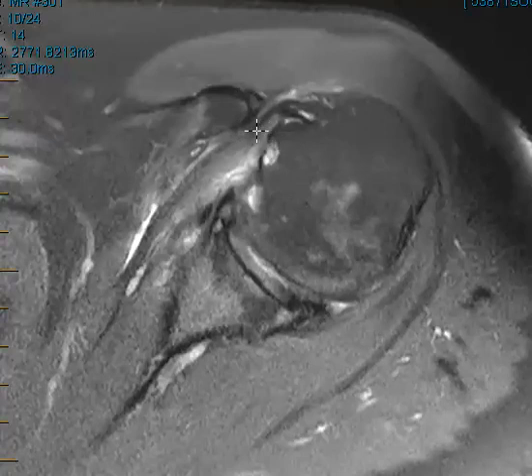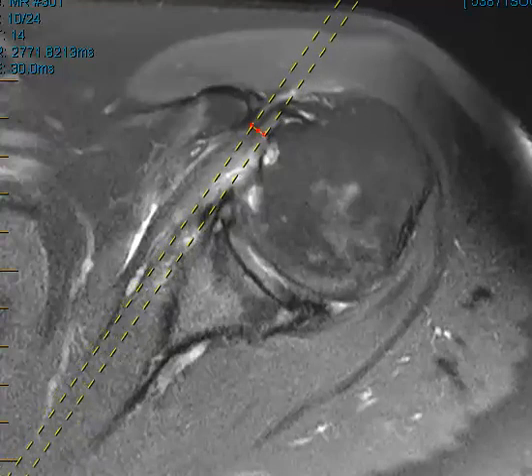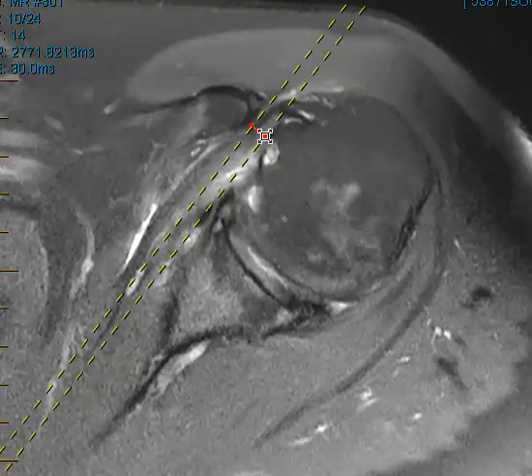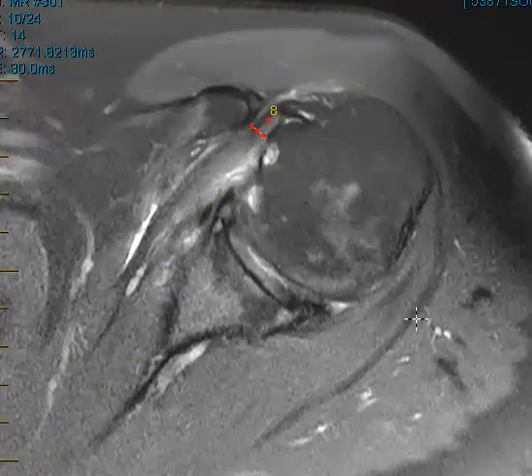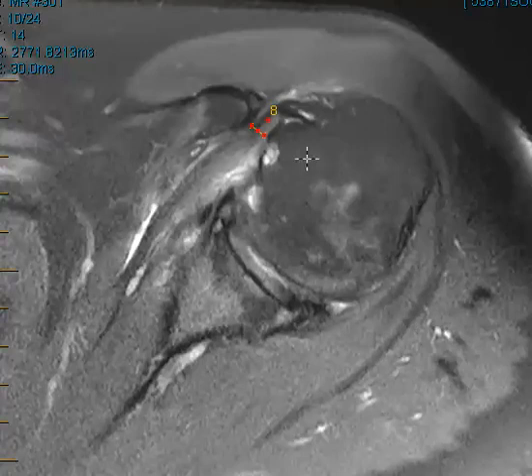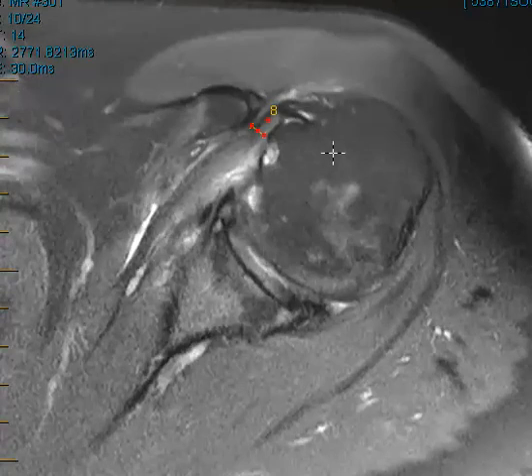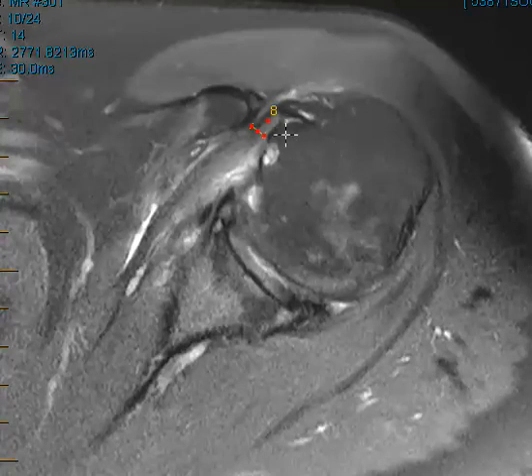Anything below 7 millimeters is generally considered abnormal, or definitely 6 millimeters. We're going to measure this, and it looks like it is about 4 to 6 millimeters. I've measured it several times — this time it's 4 millimeters, the last couple times closer to 5 millimeters — but definitely less than 6 millimeters.